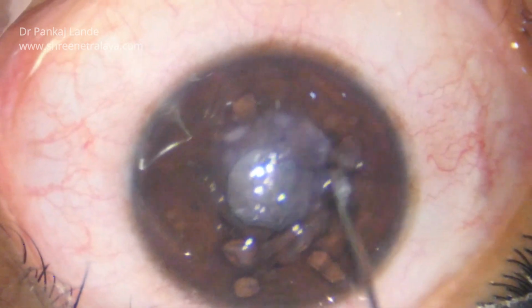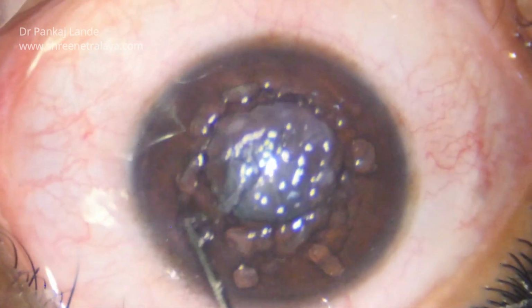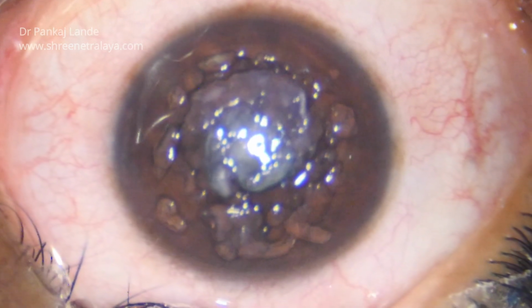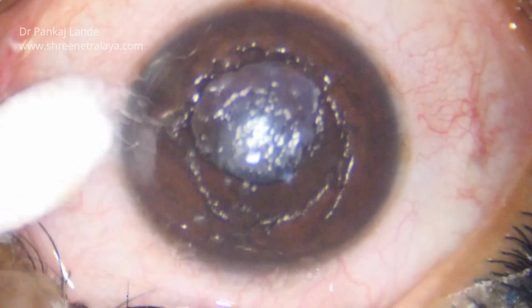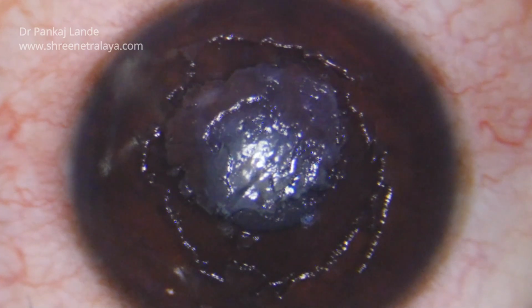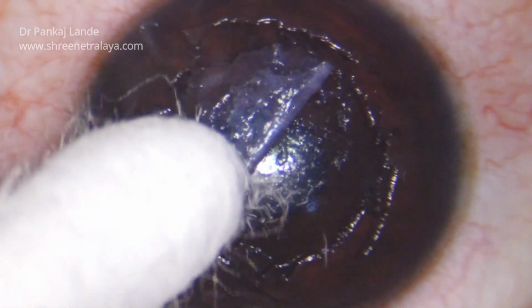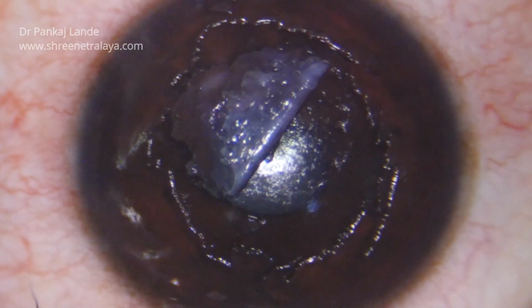The scar should not come in piecemeal, so we have to be very cautious while dissecting this scar. Try to use a cotton tip to dissect off the scar as shown here. If it is working, then it is very good. The likely chances that remaining scar is there in the residual bed is less if you use a cotton tip. Do not use the crescent directly and slowly peel off the scar.